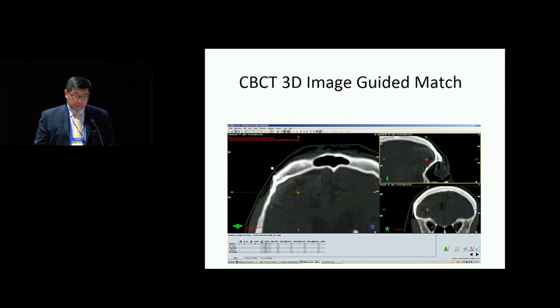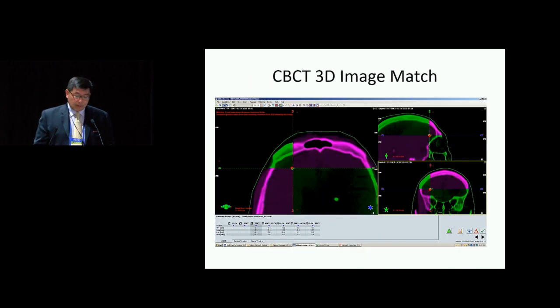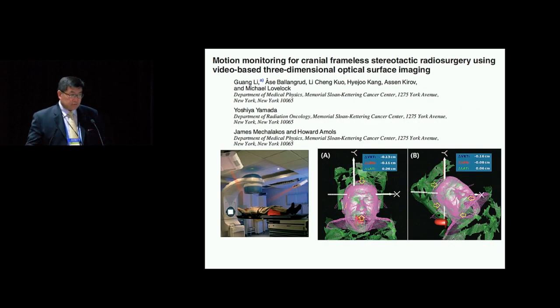And to do that, of course, we use cone beam CT imaging because it provides very detailed and accurate 3D information for positioning error delineation, and matching them very carefully, as we're all very familiar with. But to measure the amount of motion, we also use 3D surface mapping. Based on this, we were able to get a handle comparing the same patient, frame or without the frame. The surface mapping system we found to be an extremely reliable tool for this, because its accuracy both for translational and rotational errors is within tenths of a millimeter or tenths of a degree.